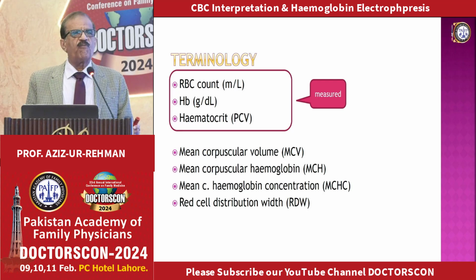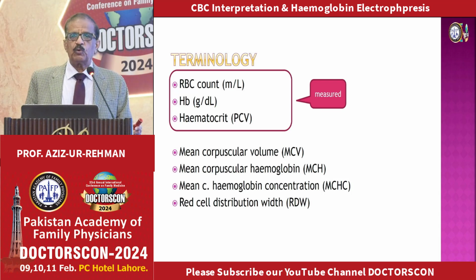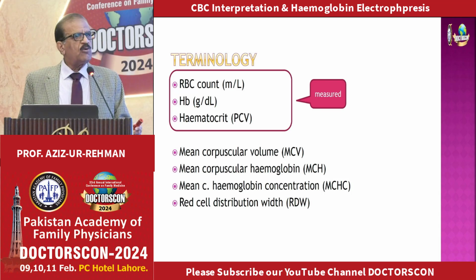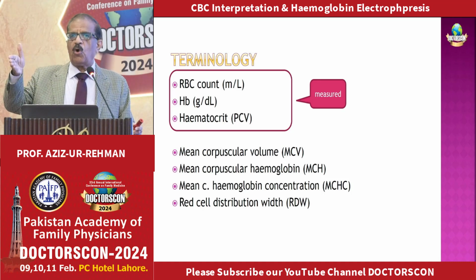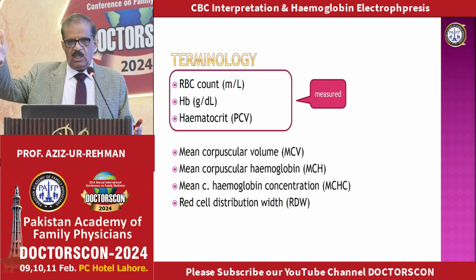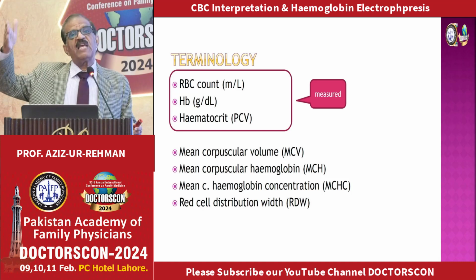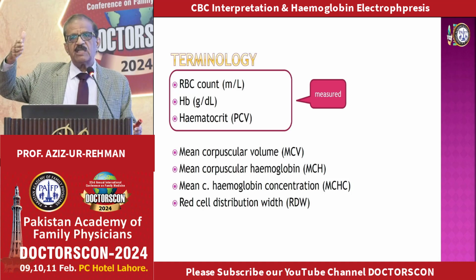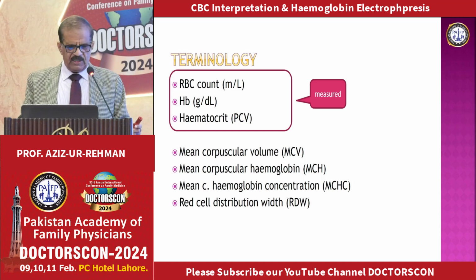Mean corpuscular volume. That refers to the volume of an individual cell. Mean corpuscular hemoglobin, that refers to the average amount of hemoglobin in one red blood cell. Mean corpuscular hemoglobin concentration refers to the concentration of hemoglobin within one cell. It is actually possible to have two cells of different sizes to have same hemoglobin, but if one is bigger than the other one, that would have probably less concentration. And I'll show you an example also.